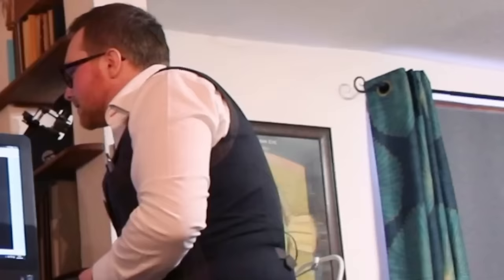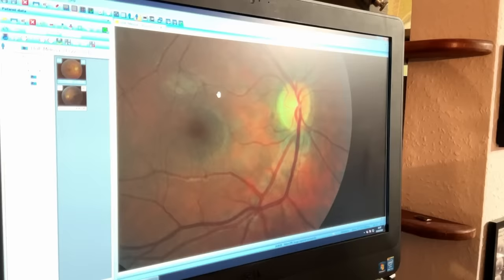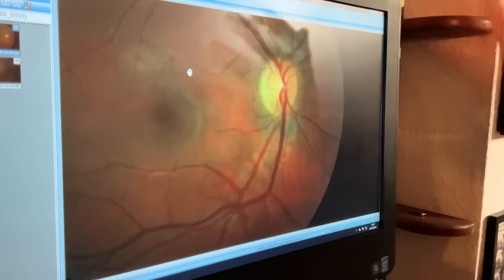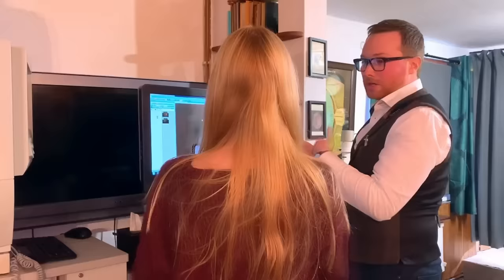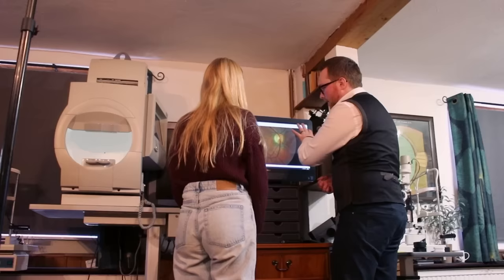So what we've got here is the optic nerve, and that's where all the information leaves our eye. It's our natural blind spot, so there's no light-sensing retina here. So when we close one eye, we do actually have a natural blind spot. With both eyes open, each eye compensates for the other eye. So we've got our optic nerve here, and we've also got the blood vessels which enter and leave the eye. We've got the lighter ones, the arteries bringing the blood into the eye, and the darker ones, the veins, taking it back out again.